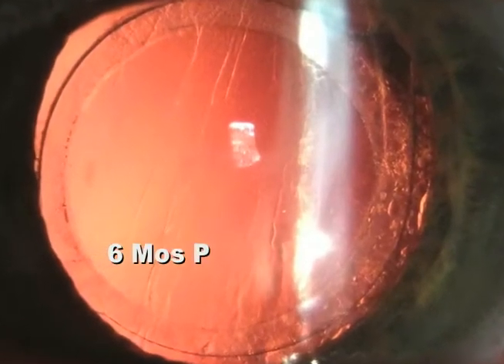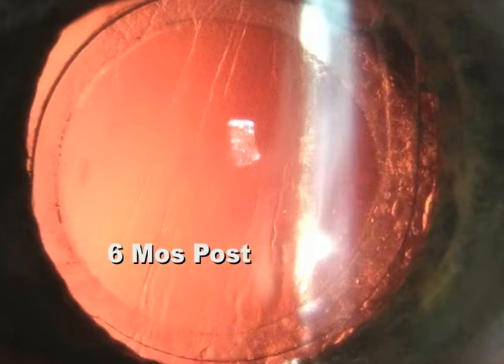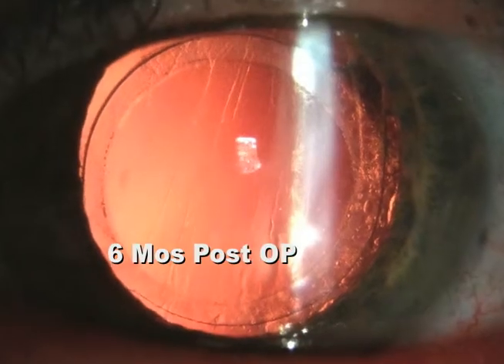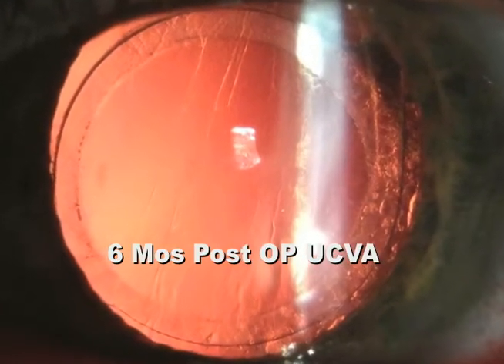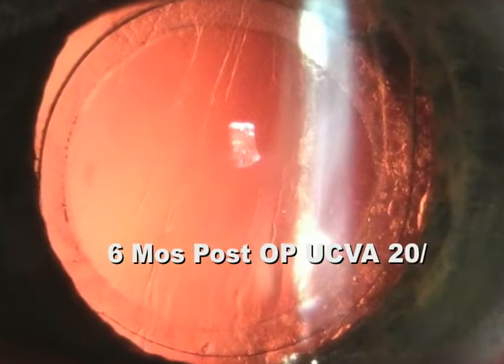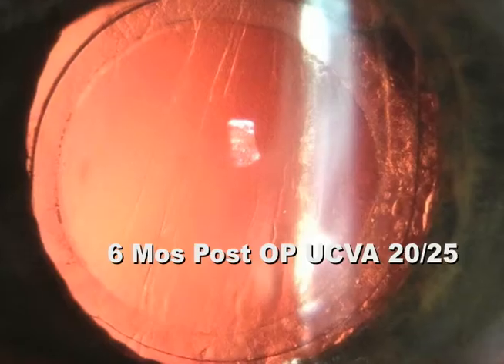Here, six months following surgery, we can note no phimosis of the anterior capsule, a perfectly centered single-piece acrylic lens, and vision improved to the 20/25 level.